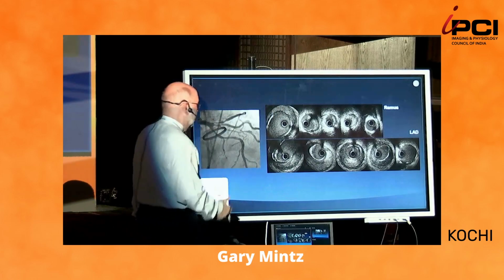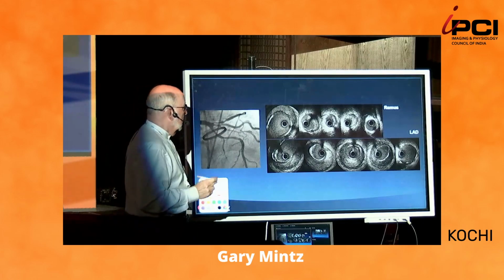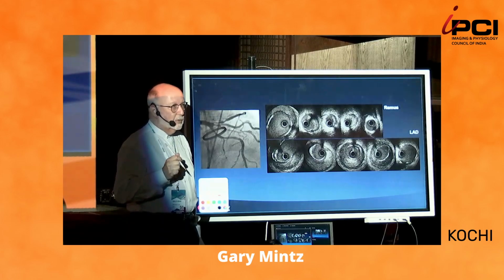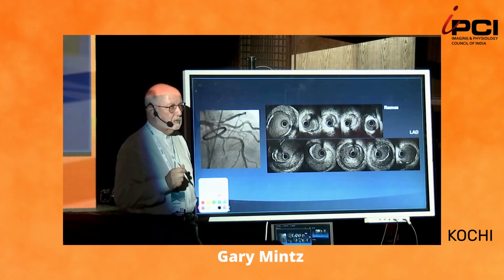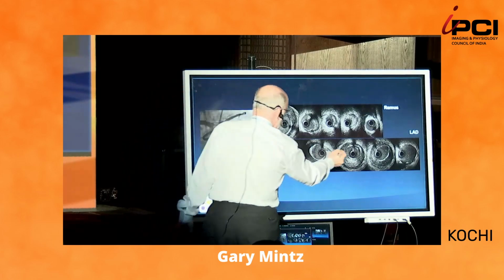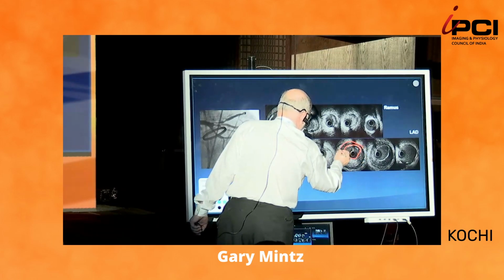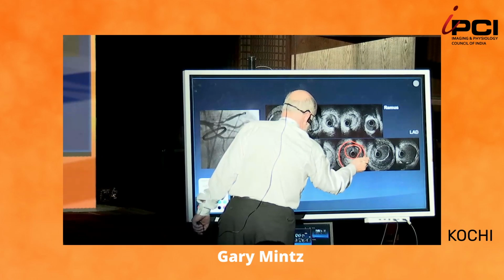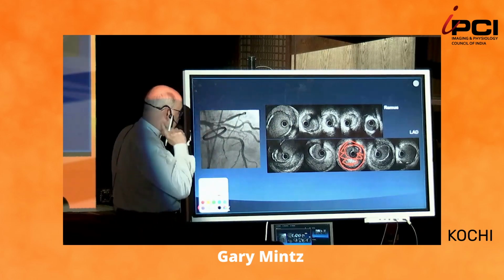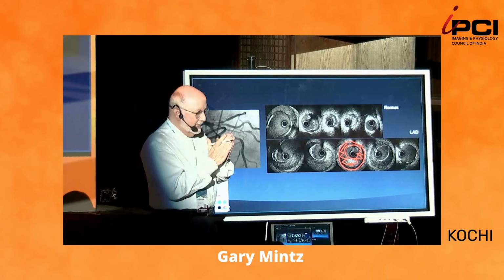Spontaneous coronary dissection. We had a whole talk about it, and everybody says, have to use OCT. That's bullshit. If you can't diagnose spontaneous coronary dissection with either IVUS or OCT without even thinking twice, you're in the wrong business. So here you can see the vessel collapsing, the adventitia expanding with hematoma formation.